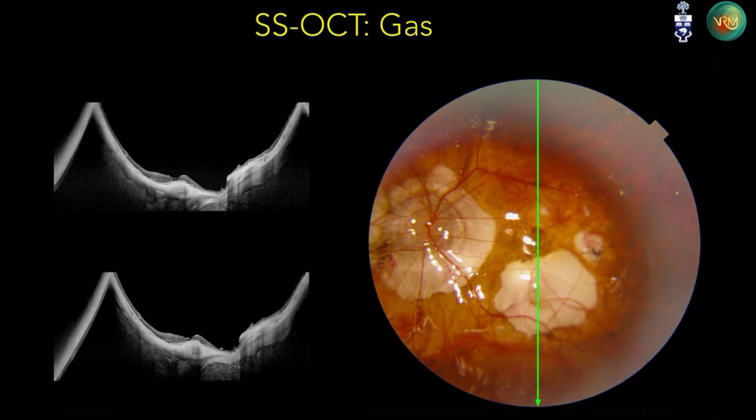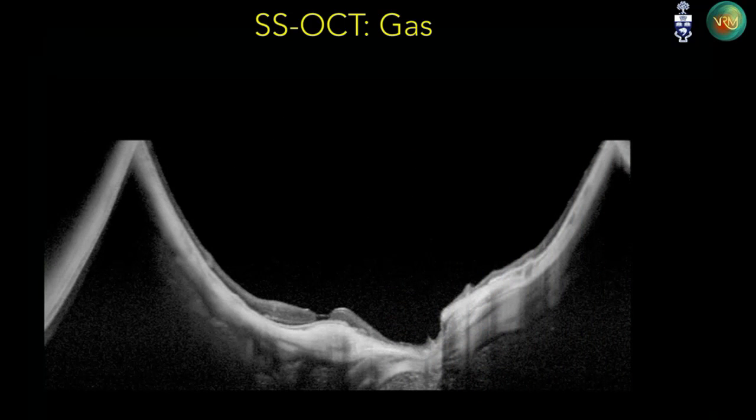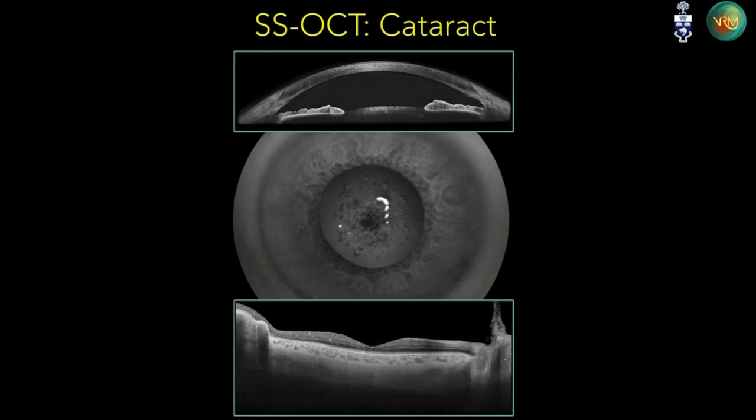What about gas? I mentioned the word gas earlier. This is another patient of mine from that study. High myope, posterior staphyloma. You can see the gas reflex coming off the fundus photograph, far left of the screen, obviously a very long and complicated looking eye with staphyloma changes. Very clearly, if you look up close, I see sclera, bone, orbit, and I even see my gas reflex. I can't go back, unfortunately, but you can see the gas reflex meniscus right at the fovea, and the hole was still open.